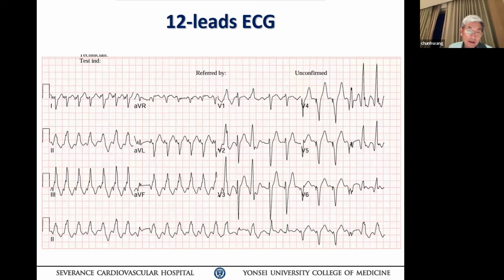How about atrial fibrillation or flutter with aberrancy? Can you exclude that with the intermittent fusion with the paced rhythm? Flutter is possible. Can explain. Flutter with 2:1 conduction is possible. So if you look at V1, right bundle morphology, it's a typical atypical aberrancy pattern.